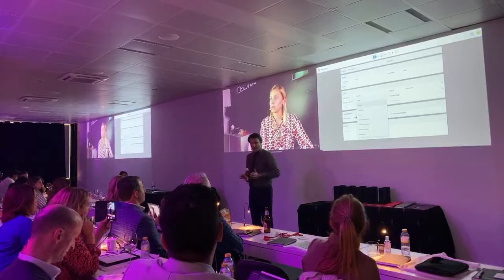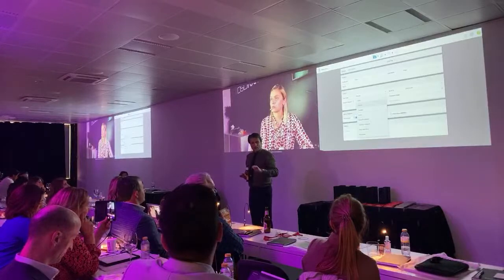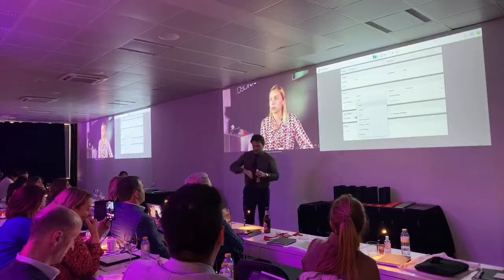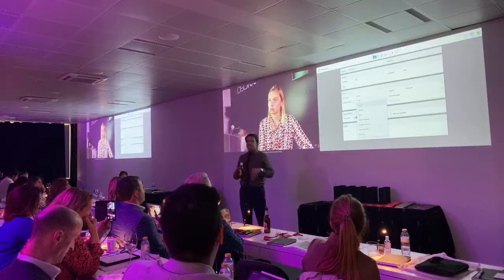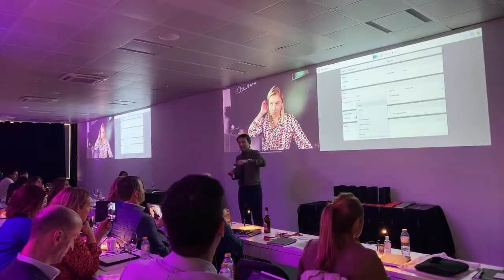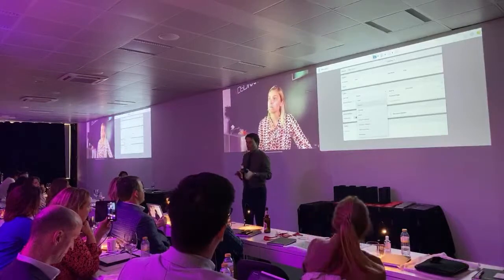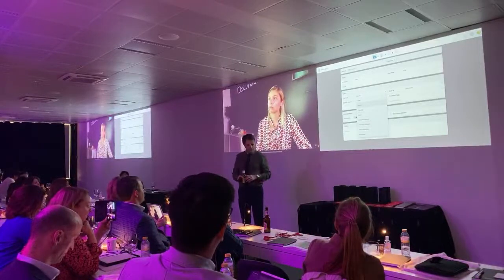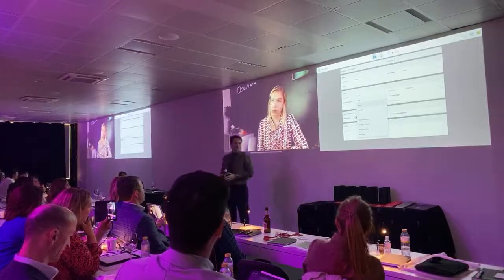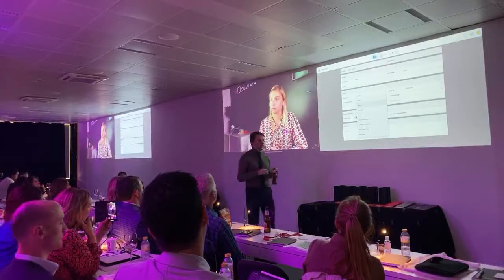implant workflow, and implant workflow is all about, all the scanners can do great job on single implant units, until 3. The question is, as you go around the arch on bigger cases, what scanners are giving you more precision that you can trust to scan and mill a restoration with passive fit, right? That's the key. So Jackie's going to mention her experience with that. And then you have the restorative. That is usually our main question. Restoratively, what is the best scanner?